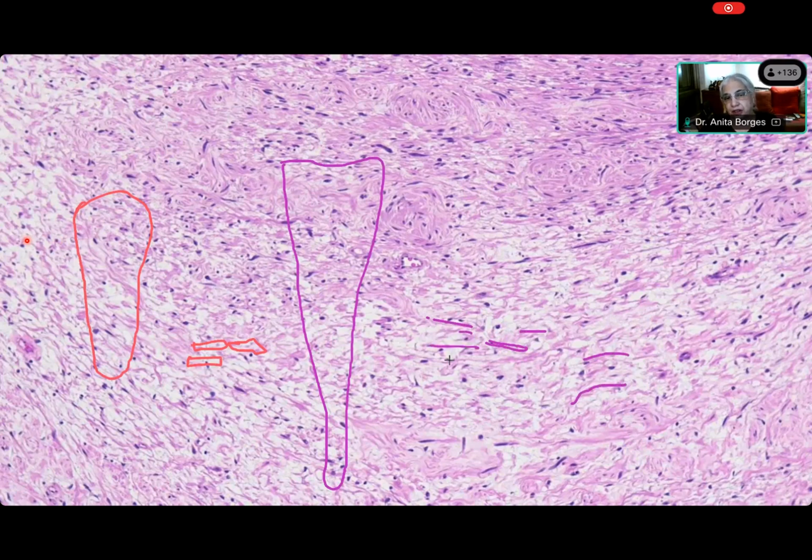So you're grating and grating and grating and you're getting long strips. Isn't that so? Yes. So this collagen is like you have been grating carrots. Okay. And that is the famous shredded carrot appearance.